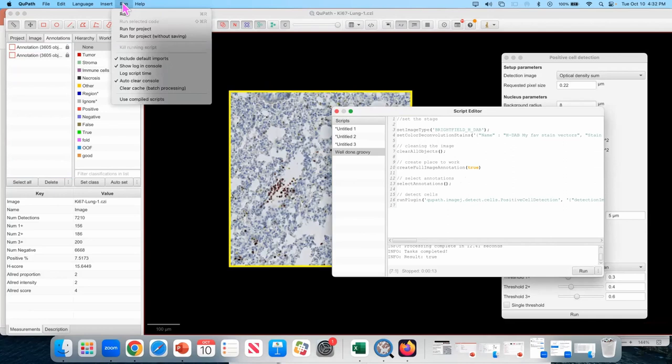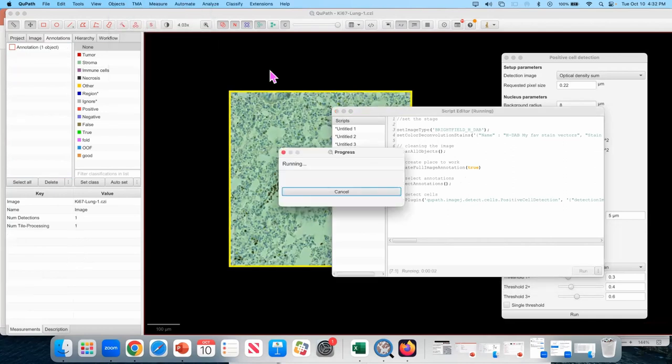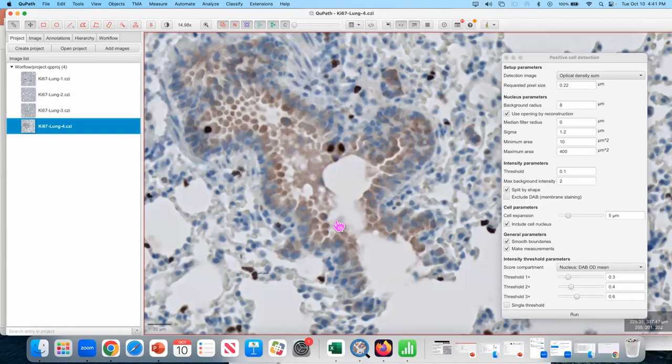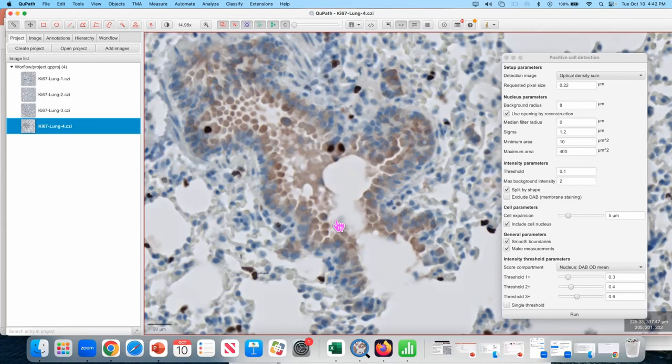Okay so this stage is something that's absolutely critical. You have to start with a clean image and make sure that it actually does what you want before you apply it for your project. Clearing out all those objects is a very standard thing for a script because you want to start from scratch, but this is why I really encourage people to have a separate project when they're creating training data yes for their pixel classifiers stuff like that. It's very easy to run for projects across your entire data set and it's gone. Unless you've backed up your project folder there is no undo button in QuPath for run for projects.